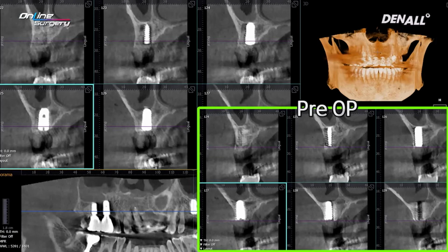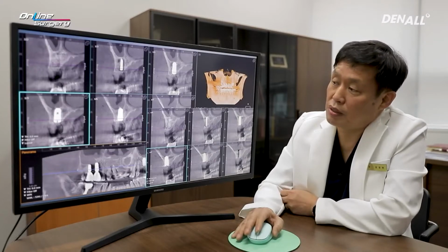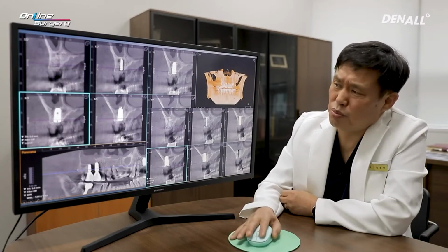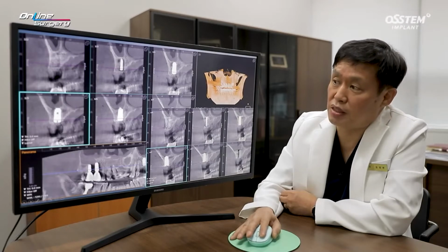I'm going to show you during the surgical video, but I did not use a trephine burr in order to avoid damage to the buccal plate, and used a high-speed fissure burr and gained fulcrum. This is the case where I removed the implant mesially, distally, or you could also use the palatal direction as well. Fortunately, we were able to place the implant in the desired position because there was residual palatal bone. The sinus floor seems to be a little bit penetrated, but it's okay, and the implant was placed nicely.